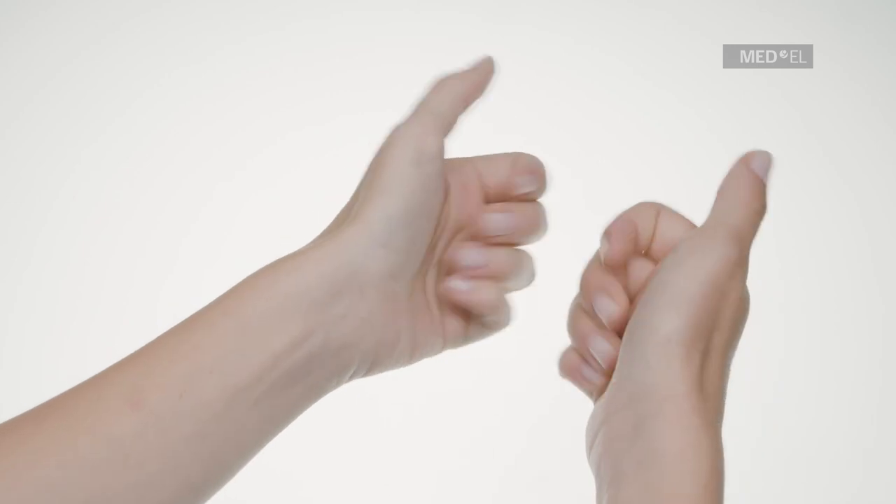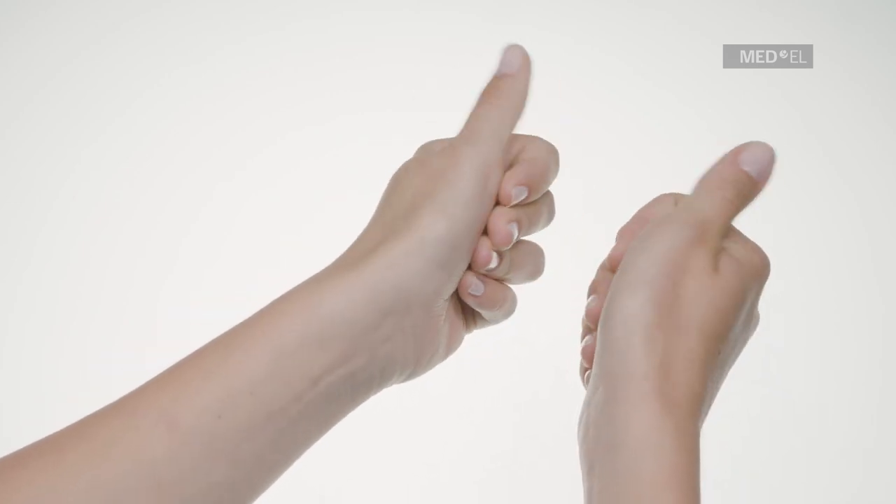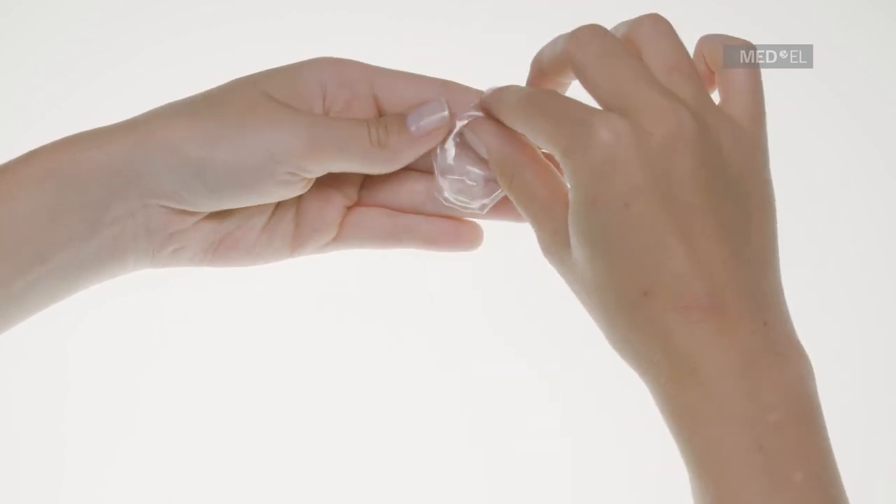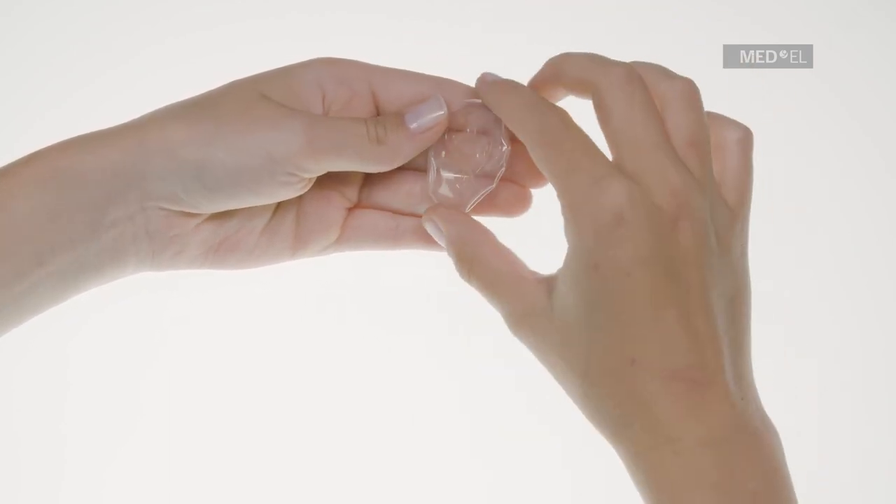Only use alkaline or silver oxide batteries with Waterwear. Make sure your hands are clean and dry before handling Waterwear. Check Waterwear for damage and make sure the inside is clean and dry.